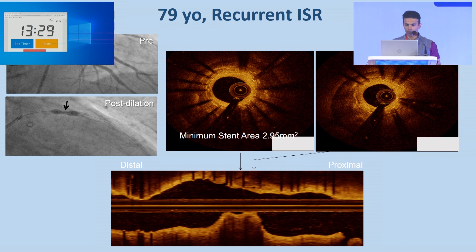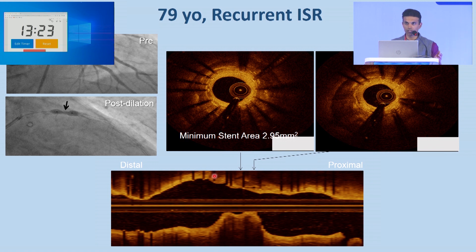Let me pull out a pointer here and point to where you have this deep, thick layer of calcium on the OCT resulting in this dramatic area of under-expansion that you know is going to be a nidus for a problem.